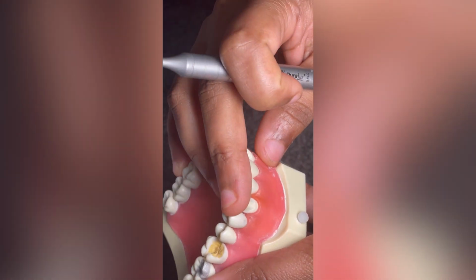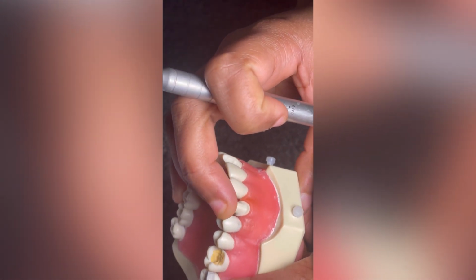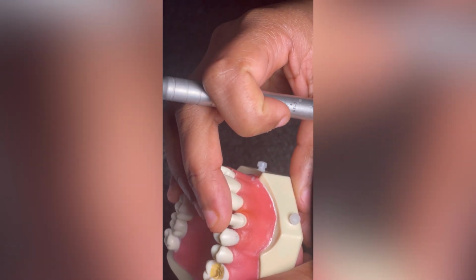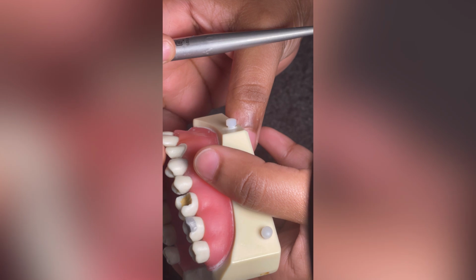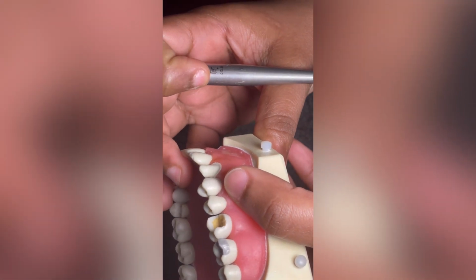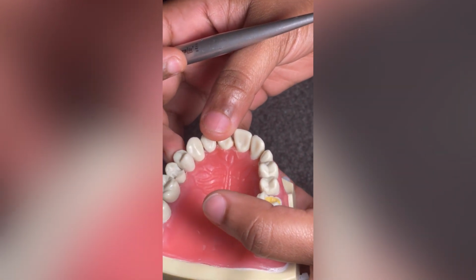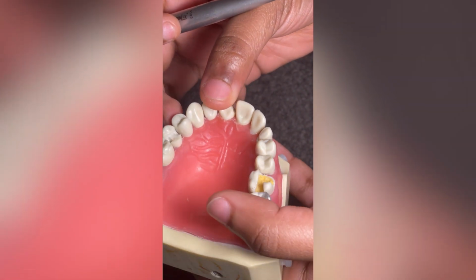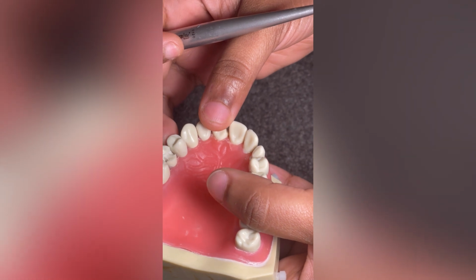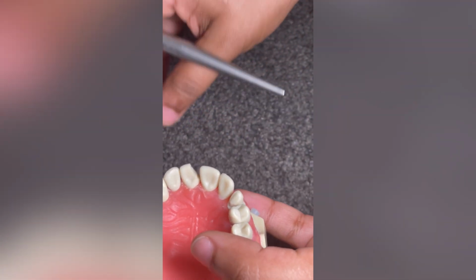Tooth selection, yes, correct tooth prepared. Path of insertion, the optimal path of insertion for final restoration. With path of insertion, we are mainly looking at the taper, and looking at this, it looks like it's got a path of insertion that can be managed by the lab. The next one is undercuts.